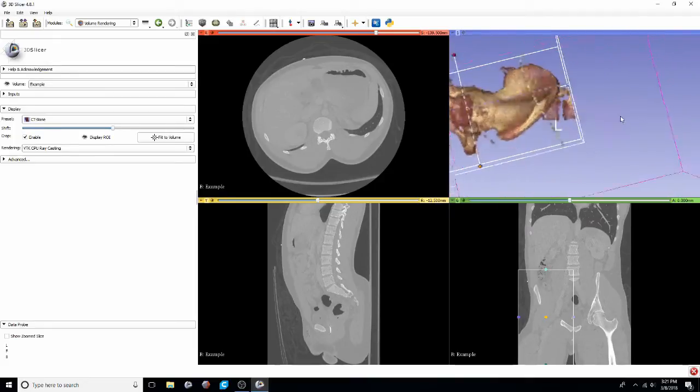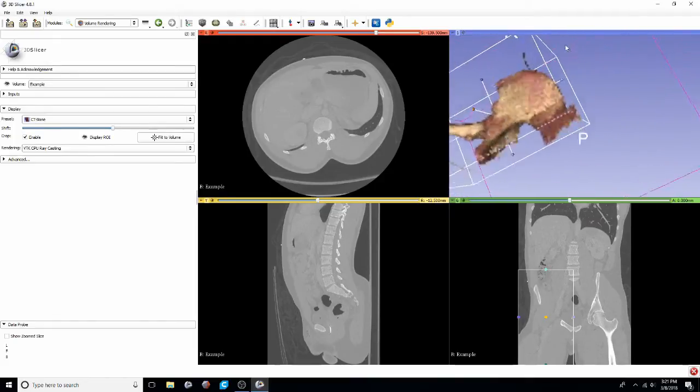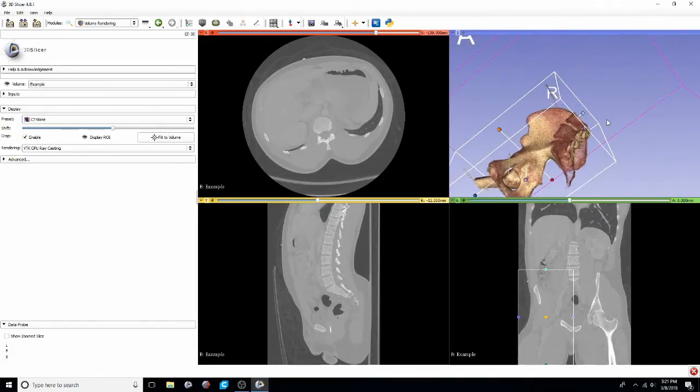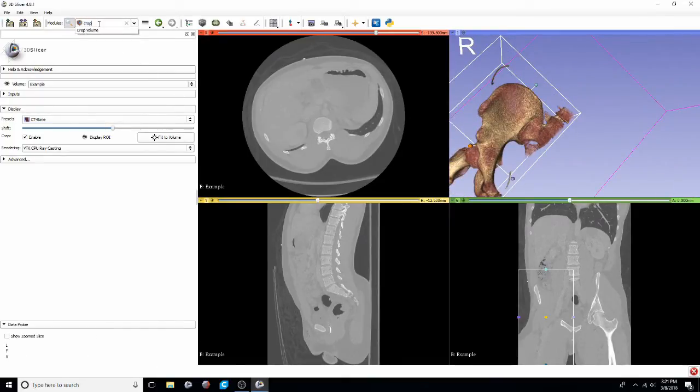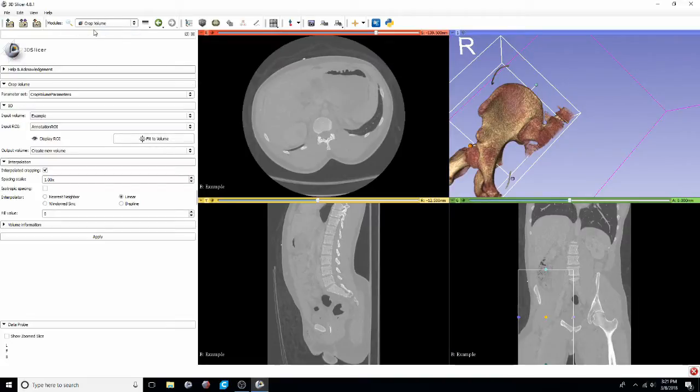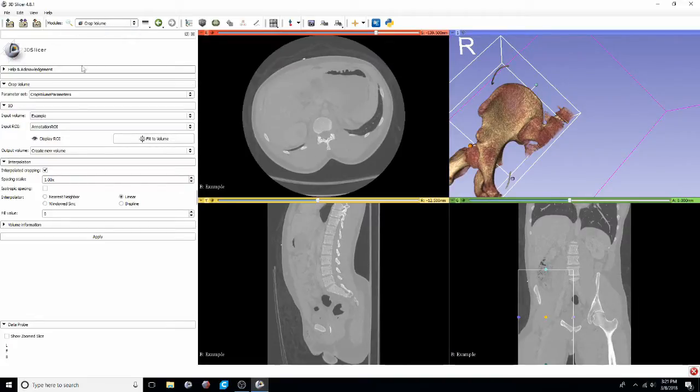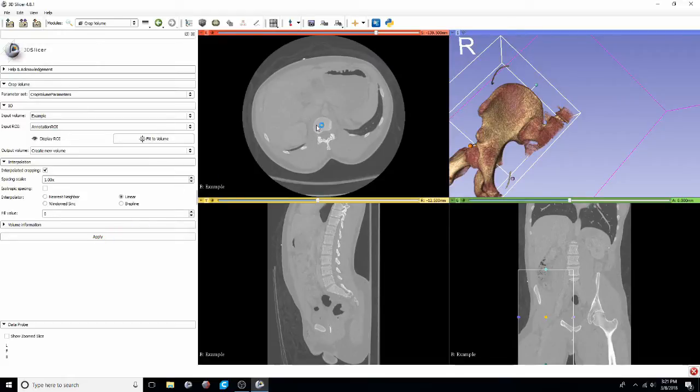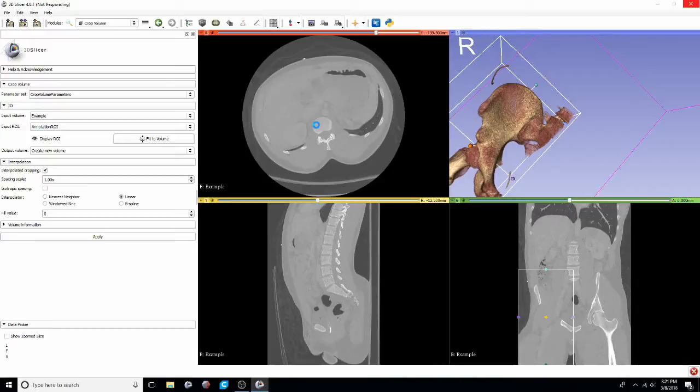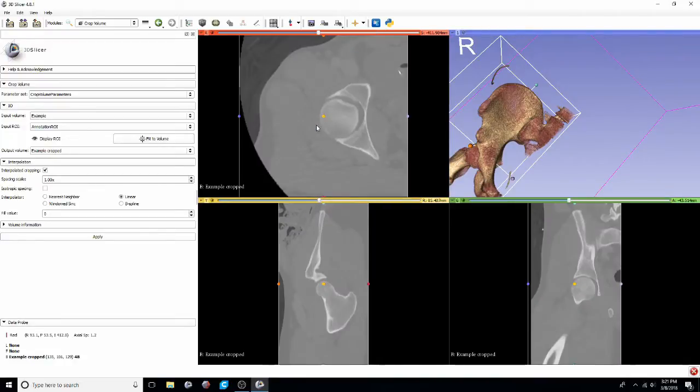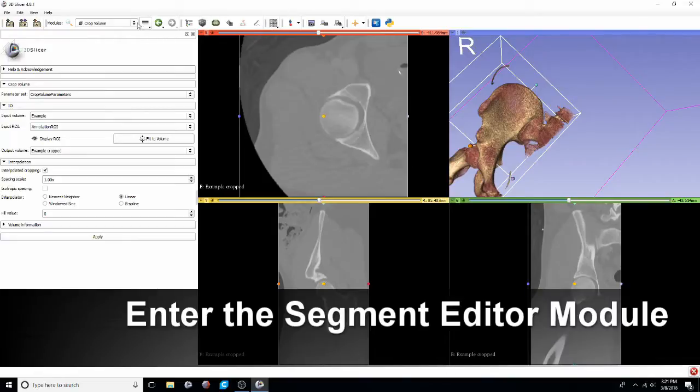Once we're happy with the way that we've cropped down that volume, we'll go to the crop volume module and just click apply. You'll see the red, yellow, and green windows all kind of zoom in on the area that we've gone down to. If you want, you can always make sure that you're including all the anatomy by going into each of those windows and scrolling through.